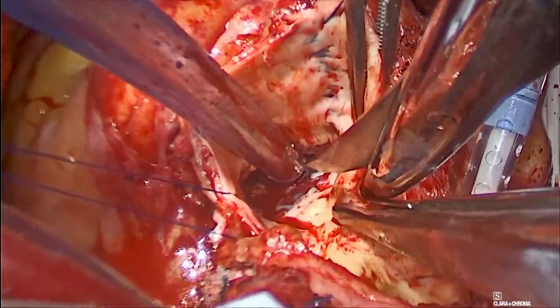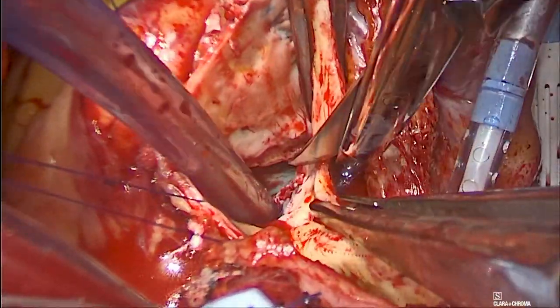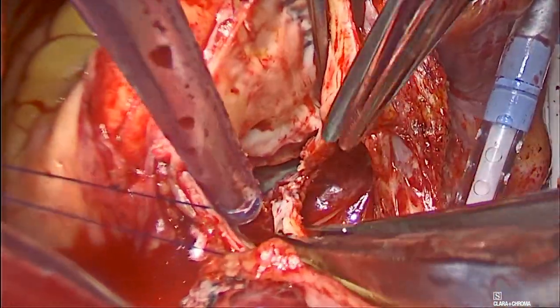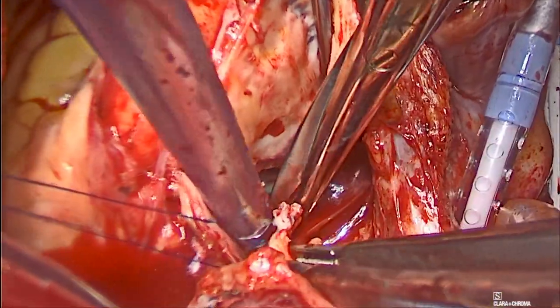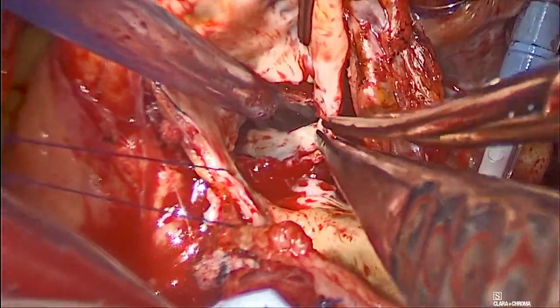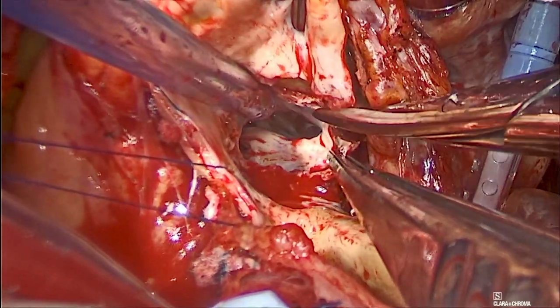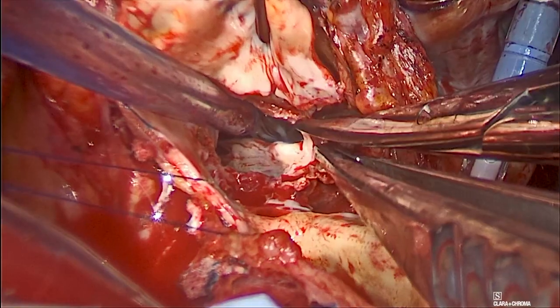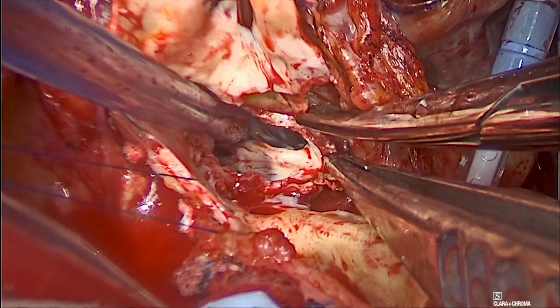We then started annular enlargement by extending the aortotomy to the commissure between the non-coronary and the left coronary cusp. We then turned the incision into the left cusp to just before the left main, and on the non-coronary side all the way until we reached the membranous septum.